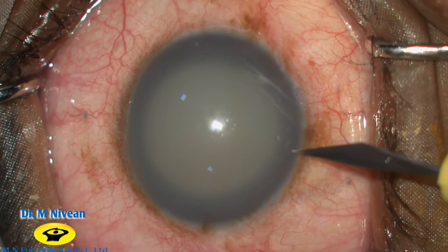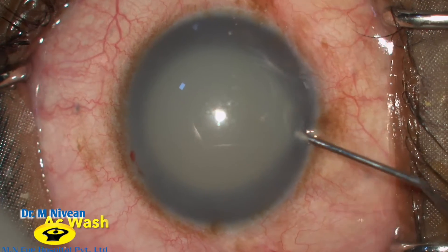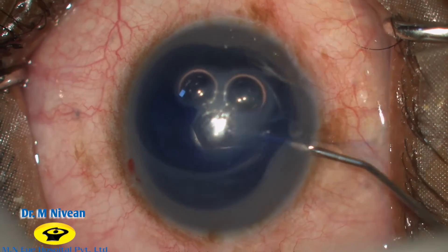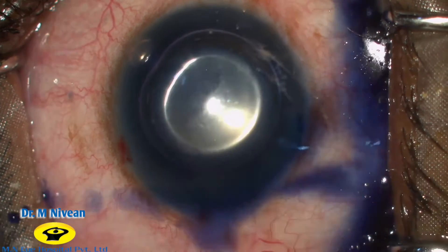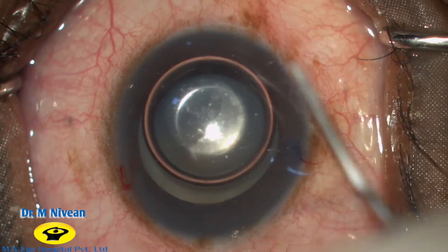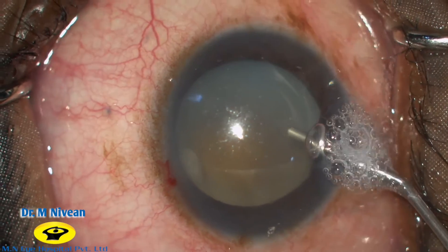The side ports are created, the anterior chamber is washed, and under the air bubble, trypan blue dye is injected to stain the anterior capsule. Viscoelastics are then injected into the anterior chamber.